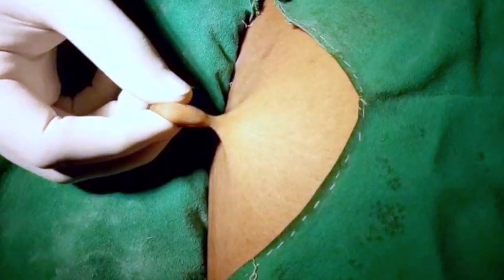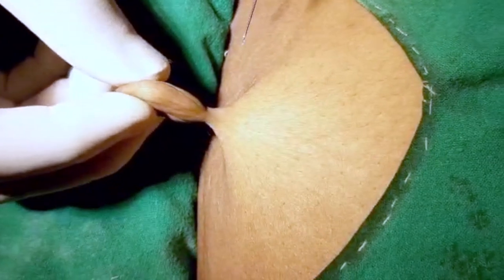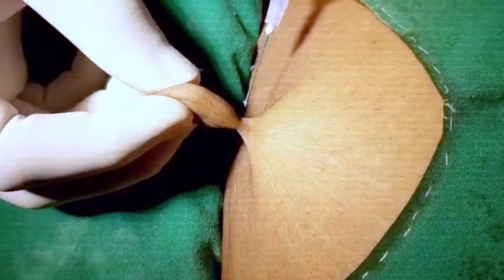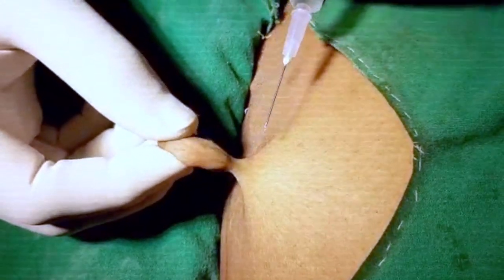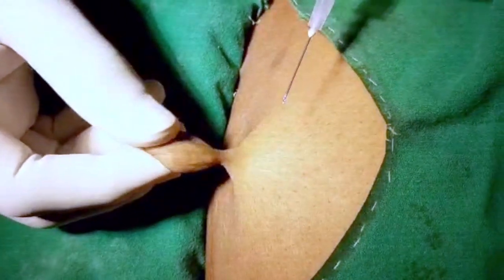Here you can see this is pedunculated — it is attached to the skin through a small pedicle. We will have to excise the mass from the pedicle. There will be a single feeder artery, a small one, and we will have to control the feeder artery before excising the mass. We will be doing it under local anaesthesia.